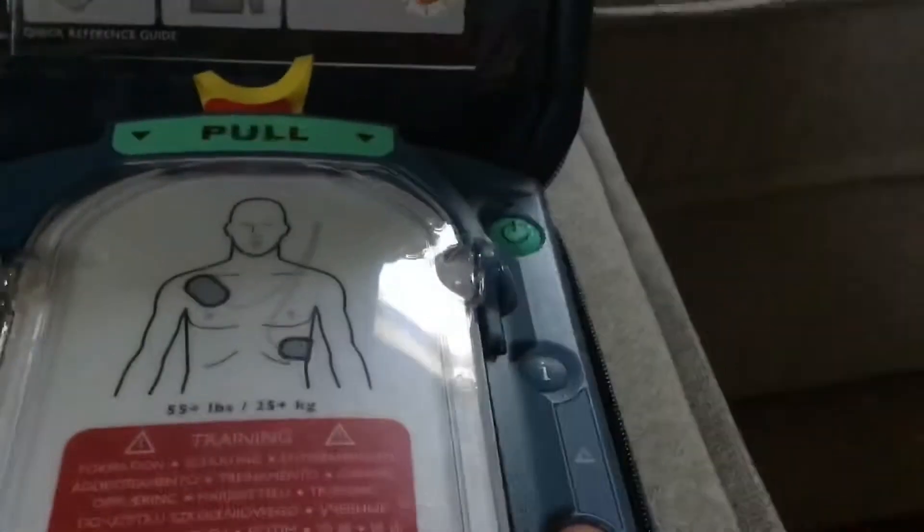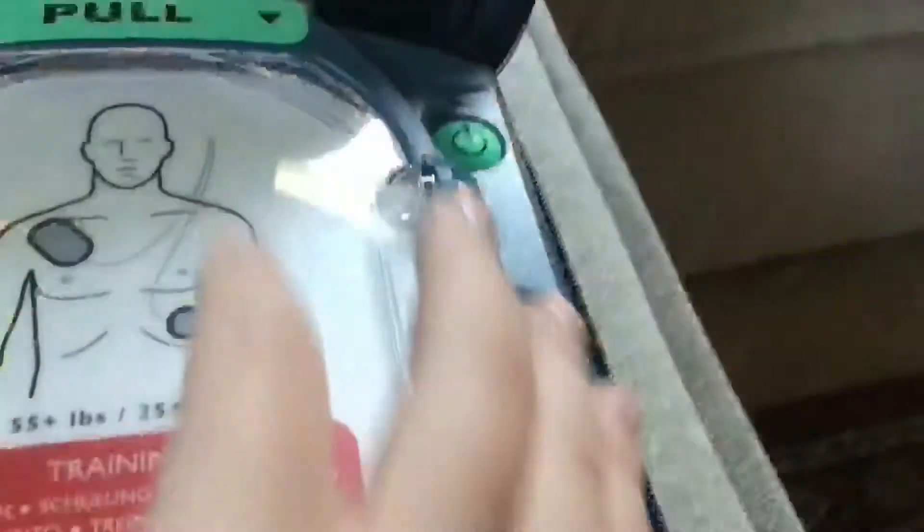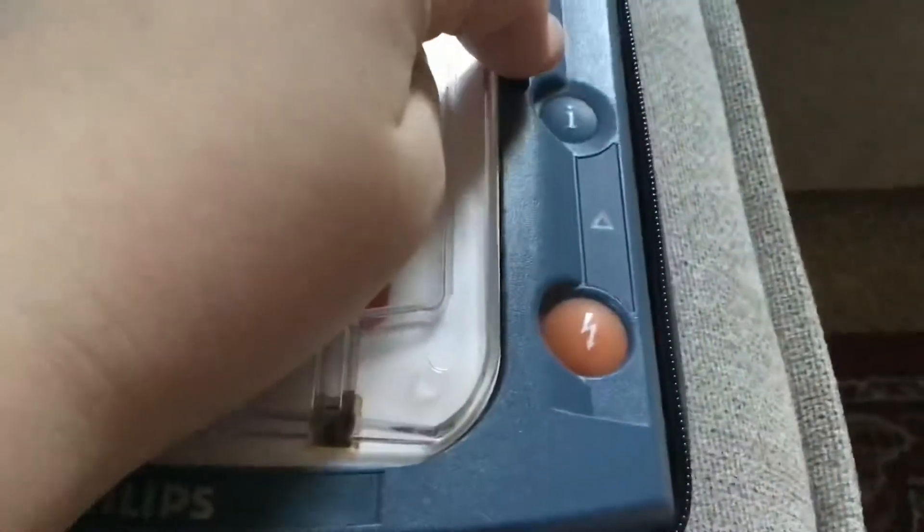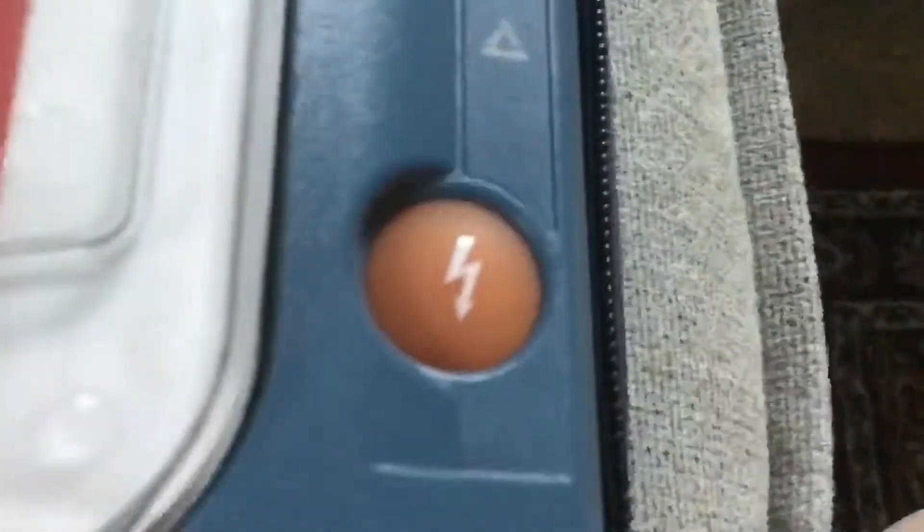Now here are all the options: the on/off button, the info button — which on this device would change the scenario or tell you the battery level. There's the warning light for when you shouldn't be touching a patient, and there's the shock button.